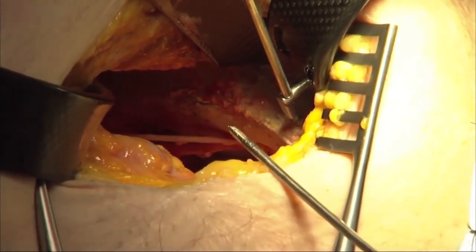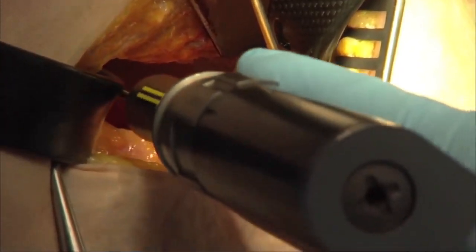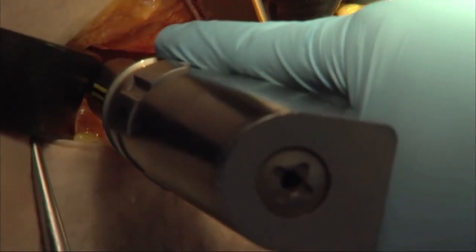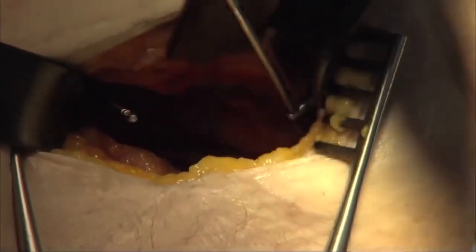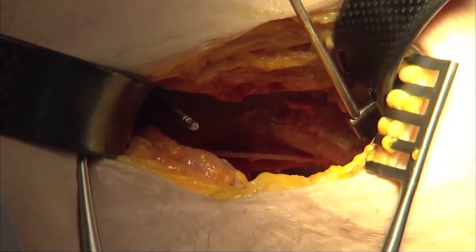In order to stabilize this retractor, we'll place another one of the stabilizing pins into the receptacle in the retractor to hold it out of the way. And again, like Mike mentioned, these are carbon fiber retractors, so once they're pinned in place, we don't have to take them out in order to get good visualization with the fluoroscopy or the C-arm.